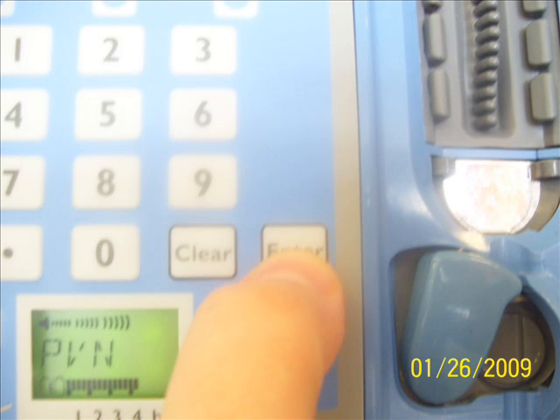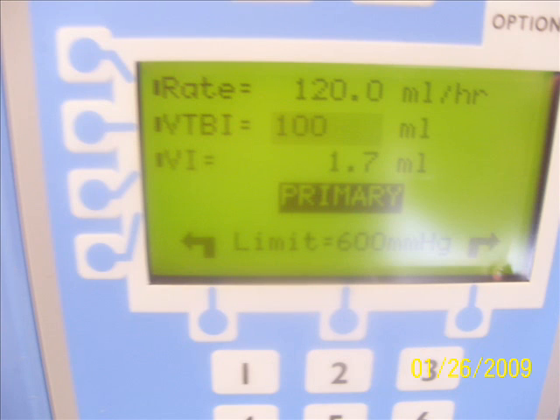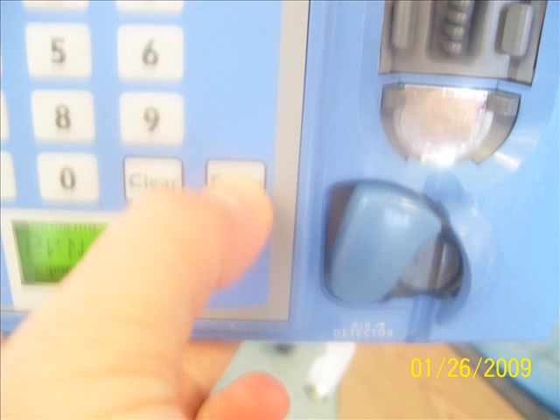When we are setting the rate and volume to be infused, we must hit enter before the pump will recognize it as a new value. If we are changing only one value — rate or volume to be infused — we can press the left side buttons and enter that value. When it says 'complete entry,' it is asking us to press the enter button, and at that time the pump will recognize it as the value.